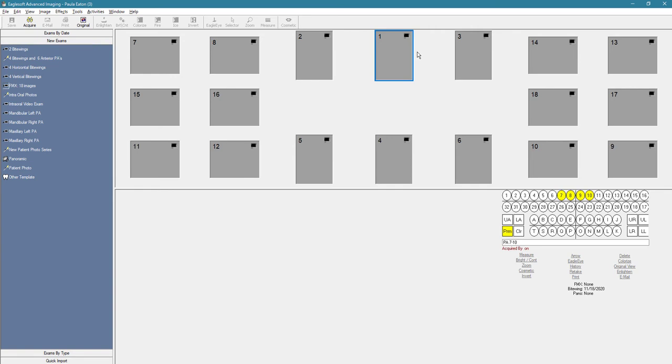And once the computer is done processing this particular image, the computer is going to auto advance to box number two.